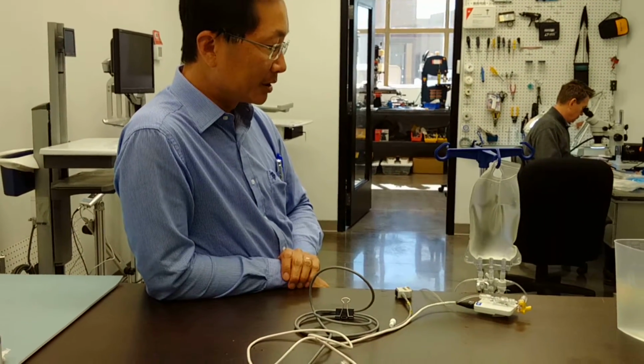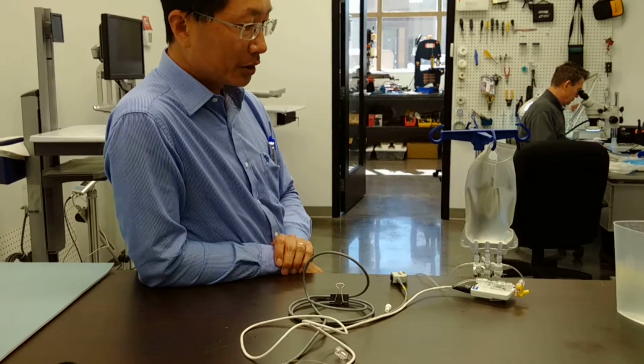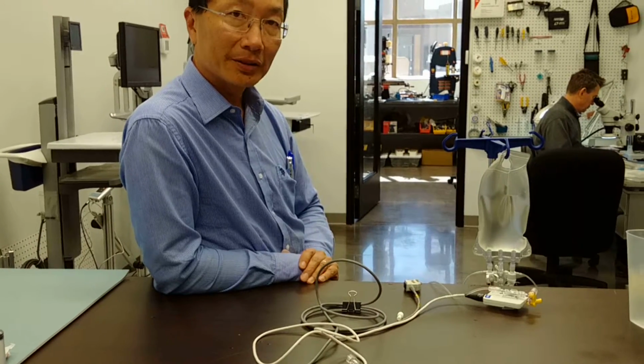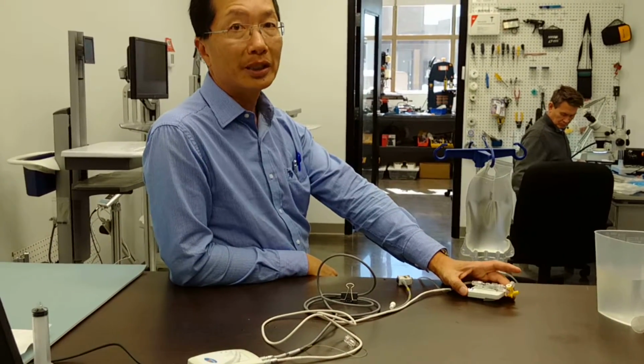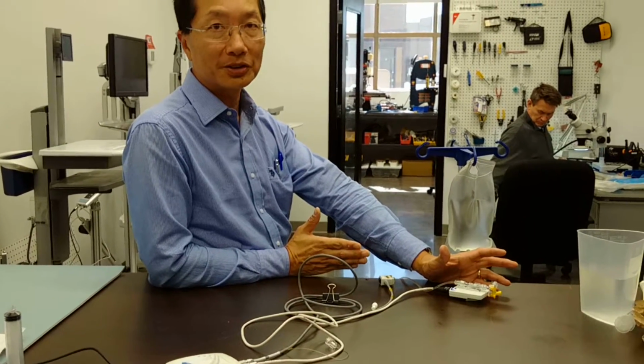Connection where we have both air and water together on the same catheter. We described initially the benefits because not only for a comparison study, you can start both channels exactly at the same value, but it has clinical applications as well because it helps you guide exactly how far the transducer has to be placed in order to get the correct starting pressure. Of course, we're still assuming symphysis pubis is in the right location when we start the test, say when the patient is in a supine position.